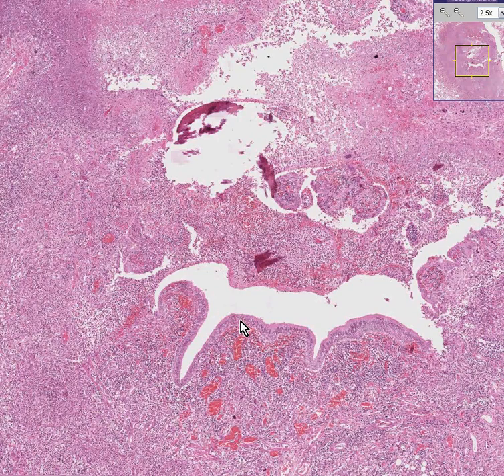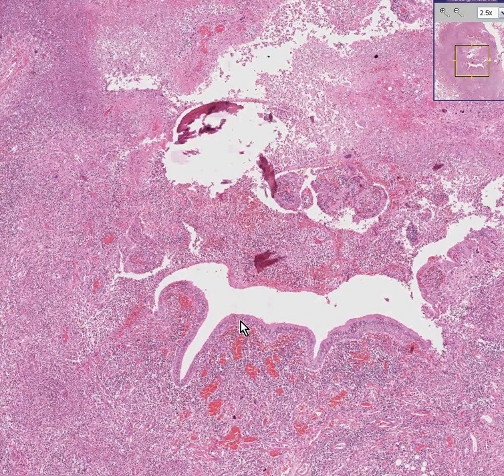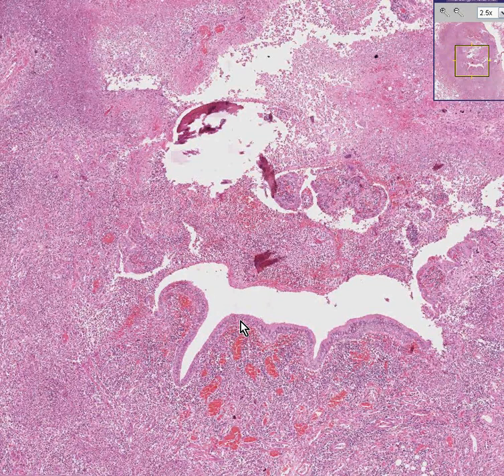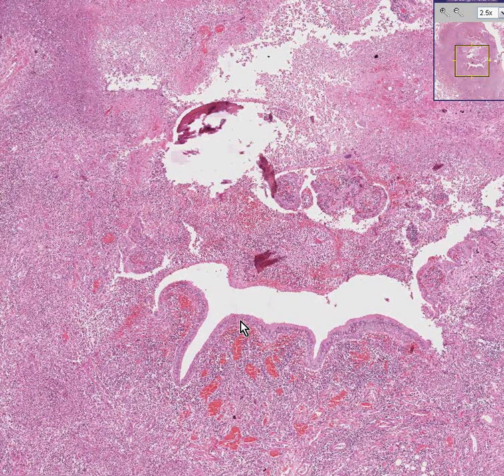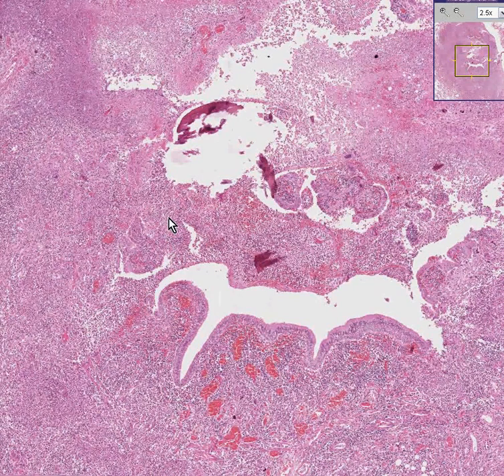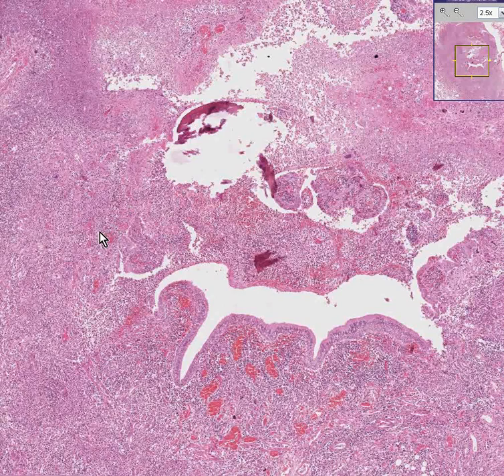This is Wegener's granulomatosis. It is a very serious necrotizing granulomatous destructive process in both the lower respiratory tract — lung — as well as the upper respiratory tract, which has a very high mortality rate. It is very poorly understood, and histologically it can be described as a necrotizing granuloma.